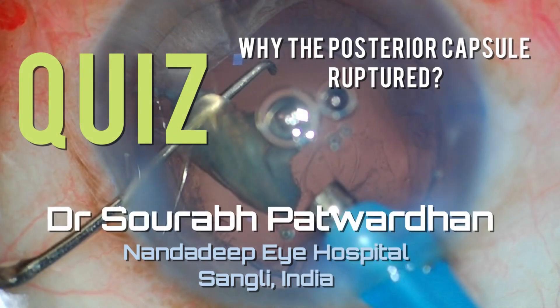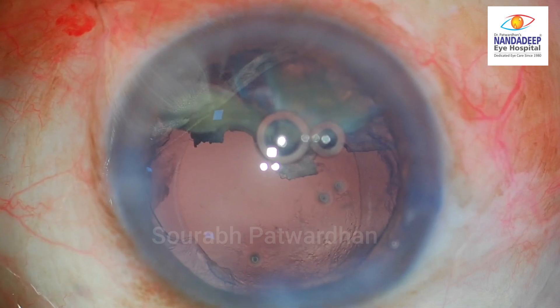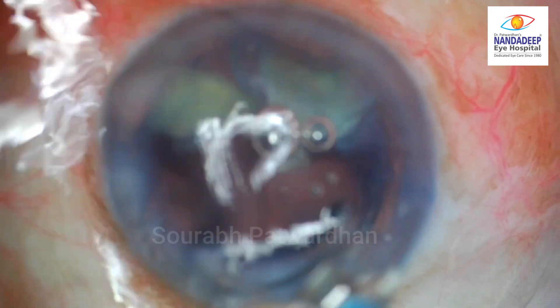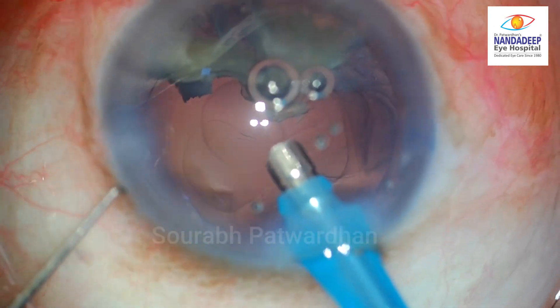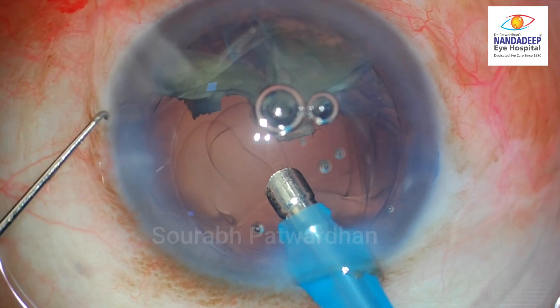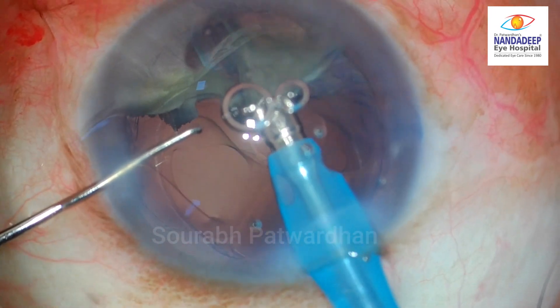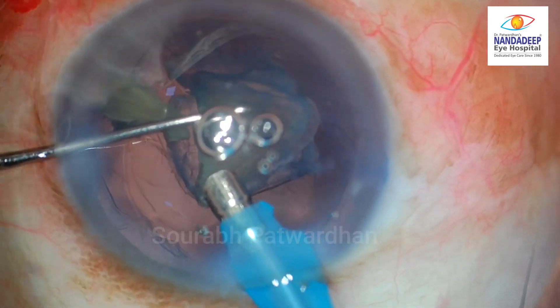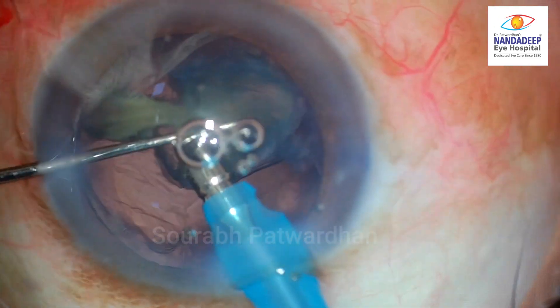This is a quiz video — why did the posterior capsule rupture in this case? The surgeon has already inflated the chamber with a viscoelastic agent, which is a good thing to do. The surgeon is using the phaco machine, going for the last piece. These quiz videos are meant to make you think, and that might help you in the next case you are going to do in the OR.